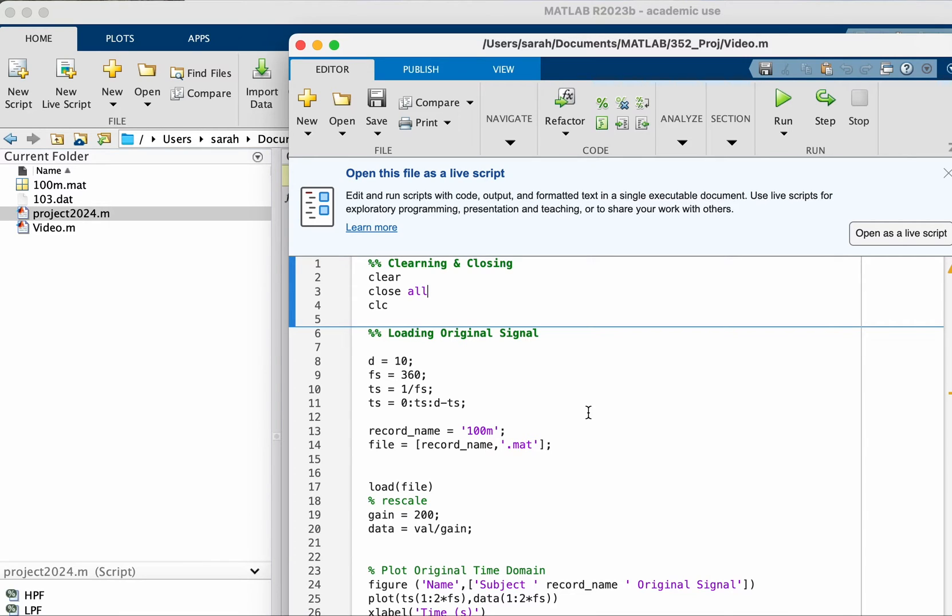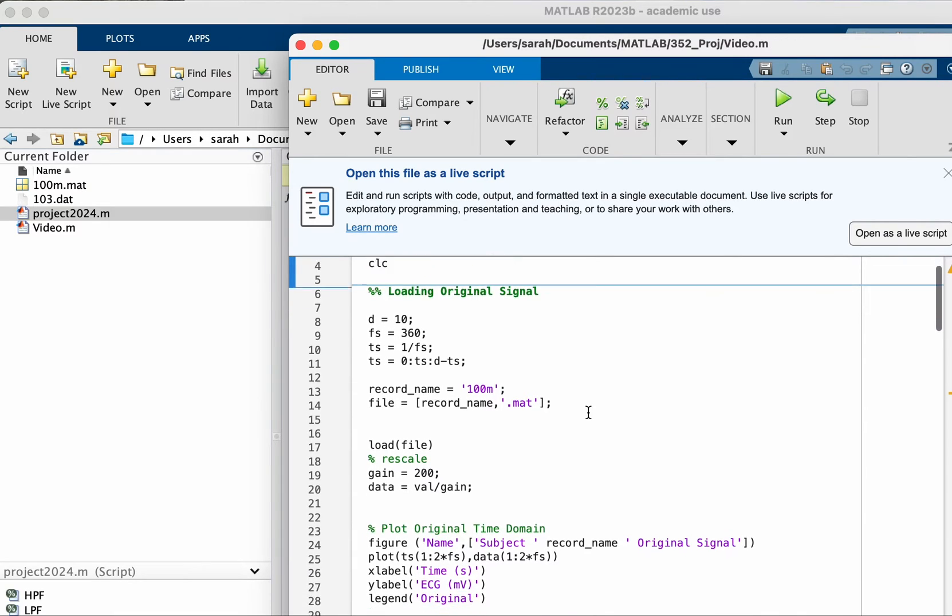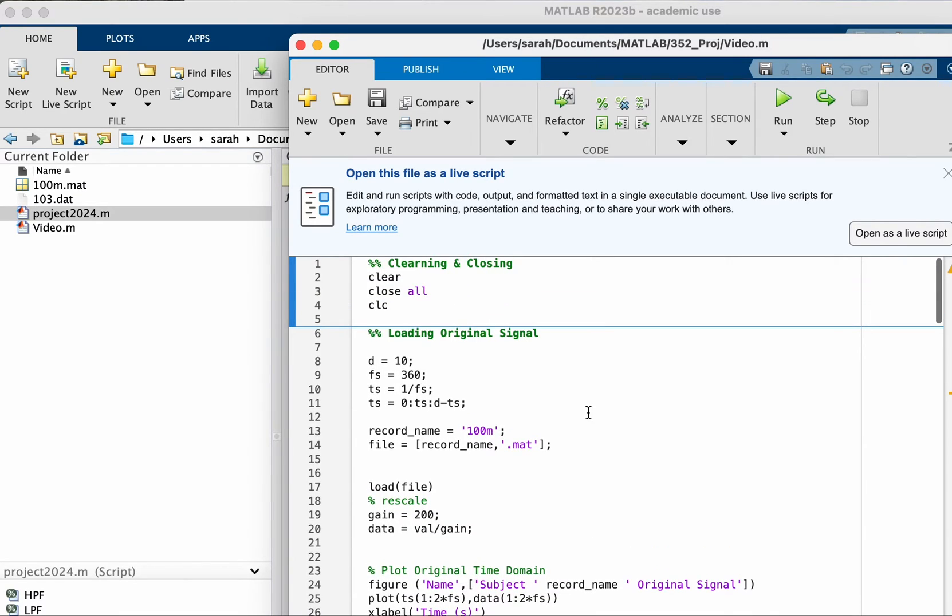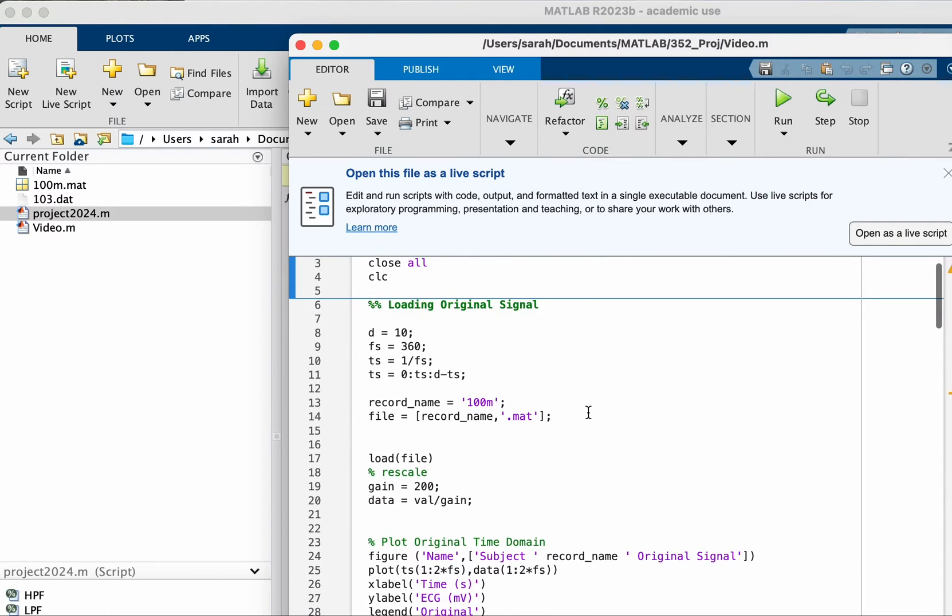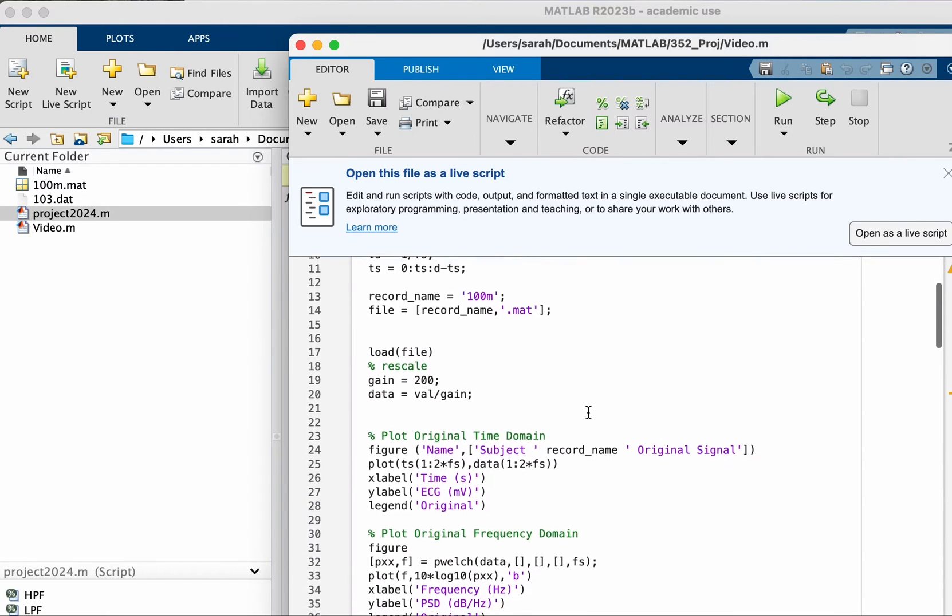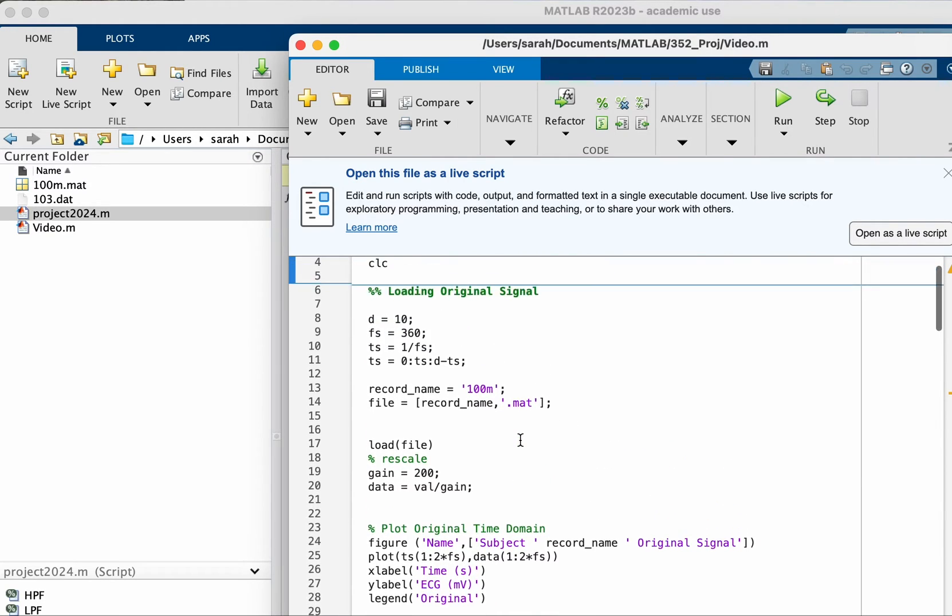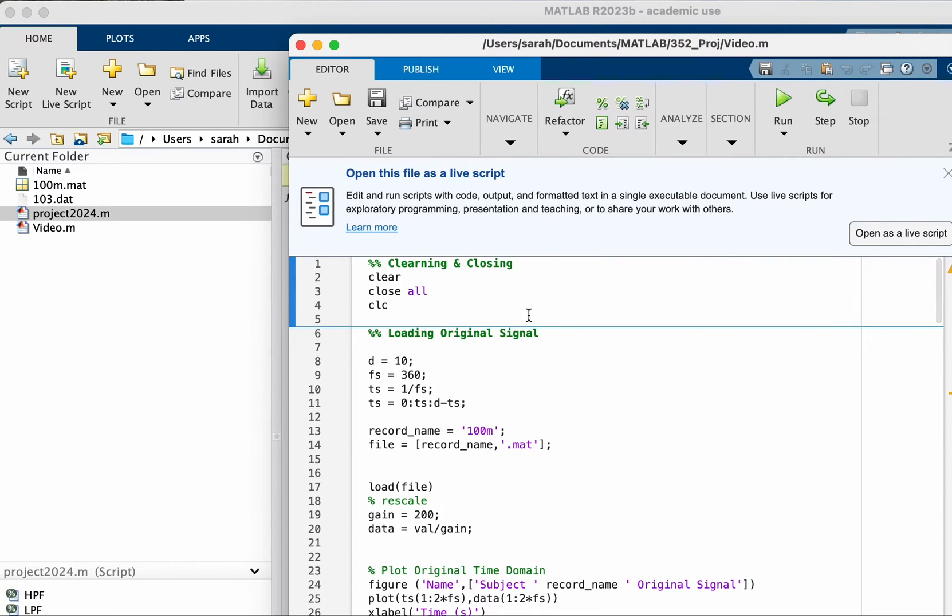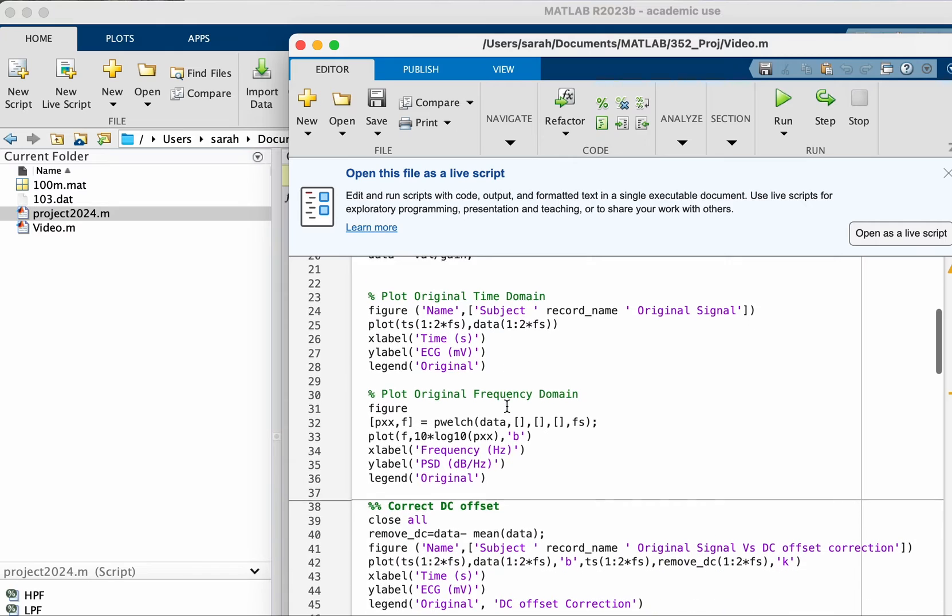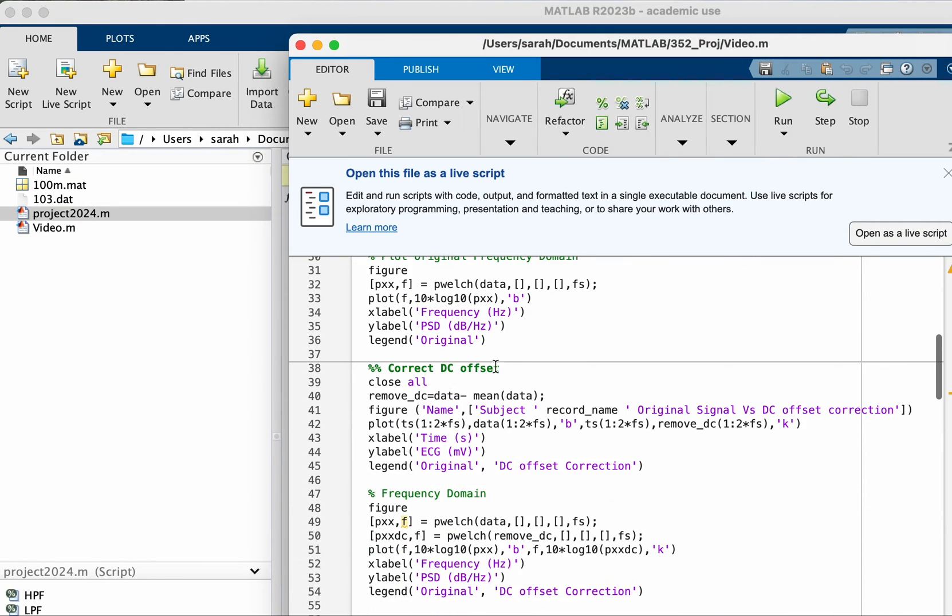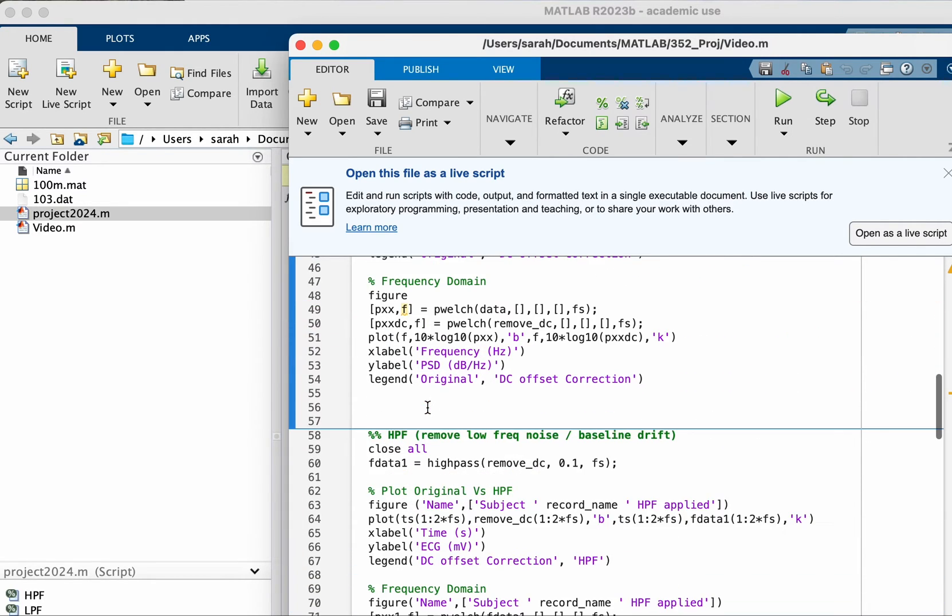Assalamu alaikum, in this video we will look at an ECG signal in the frequency domain and then we will see what filters we can apply to fix the issues that are present in the signal. Specifically I will address correcting the DC offset and then removing low frequency noise.